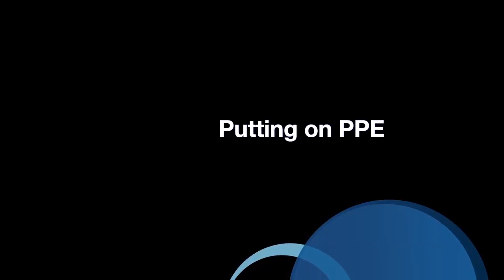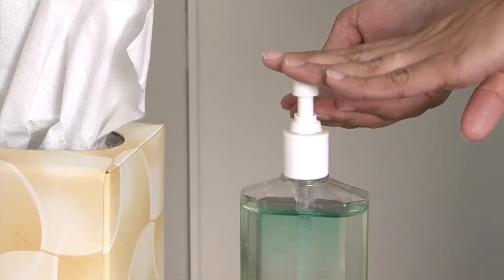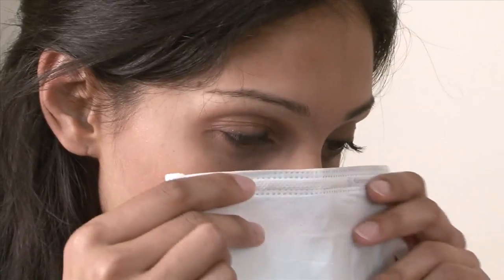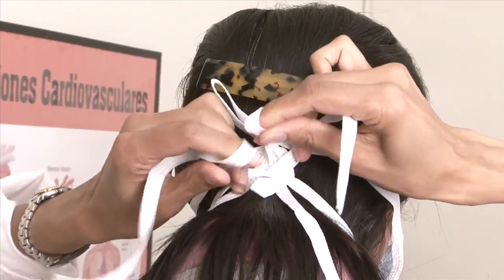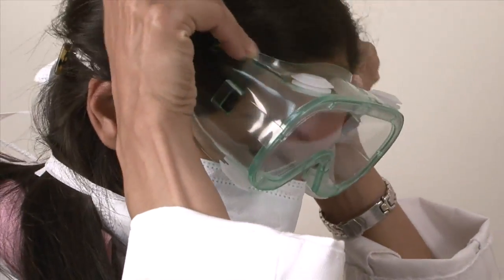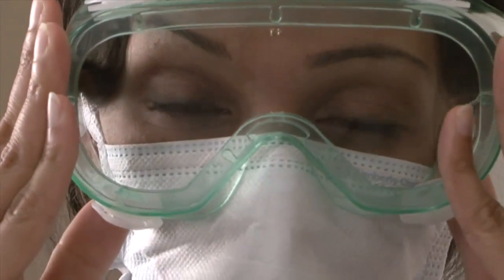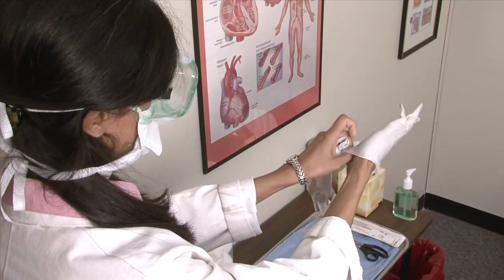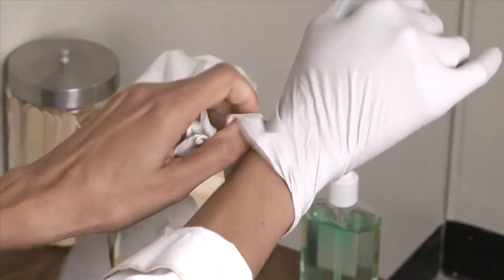Putting on PPE. Step 1: Wash hands thoroughly with soap and water or an alcohol-based hand gel. Step 2: Put on the surgical face mask and press it to fit securely over the nose and mouth. Step 3: Put on the goggles, which should cover the eyes but not interfere with vision. Note: if you wear glasses, the goggles should be worn over your glasses. Step 4: Put gloves on, ensuring that the cuffs of the glove cover the wrists.